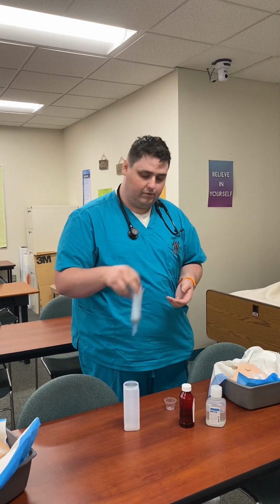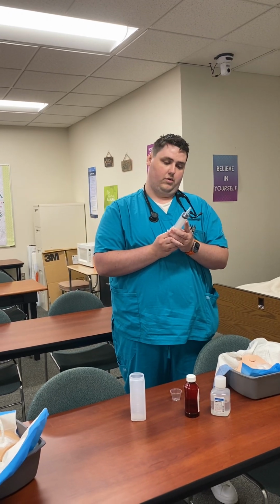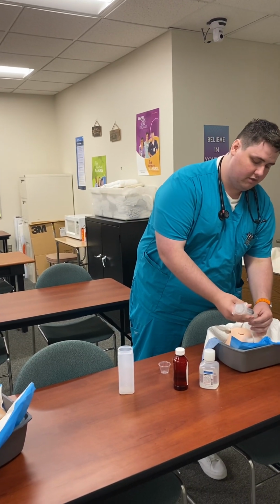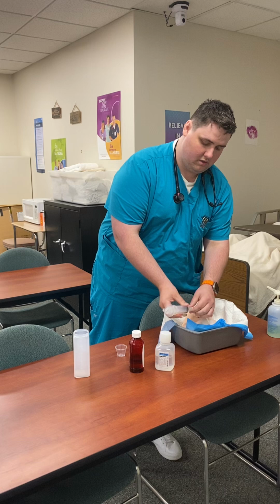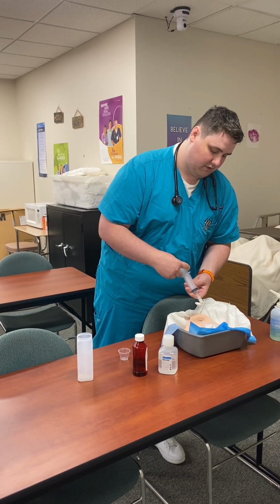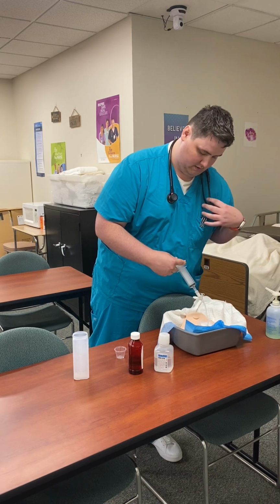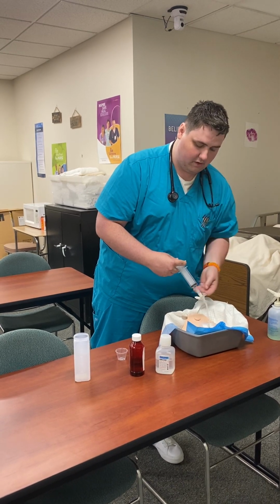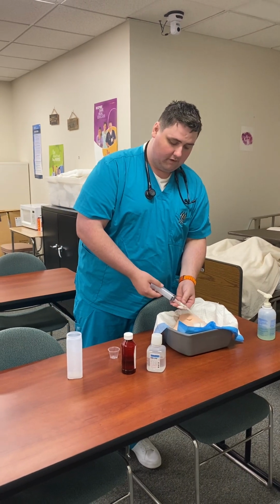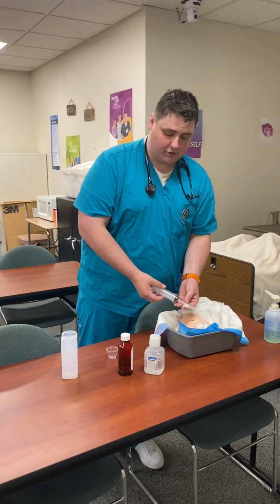So for this, we're going to use a plunger. We're going to withdraw 5 milliliters of air. We're going to connect it into our patient's port, and we will verify by inserting it and listening with our stethoscope for sounds of bubbling. With this being verified, we're able to move on with med administration.